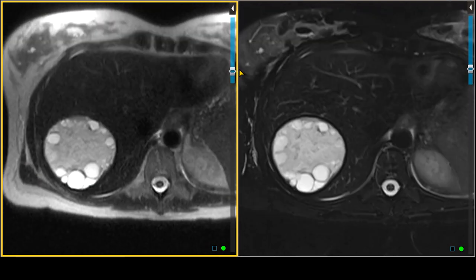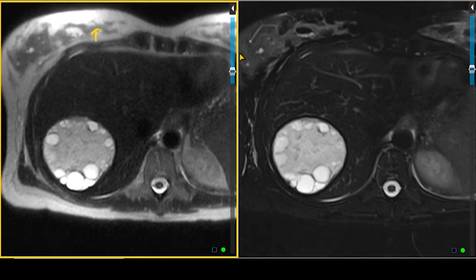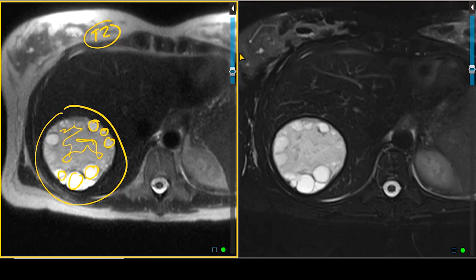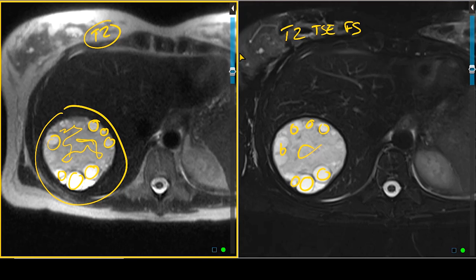On the T2-weighted images performed without fat saturation, we can see a rather large mass in the right hepatic lobe with a very interesting appearance. It is pretty well defined. Internally, it has mostly intermediate T2 signal throughout most of it. But there are discrete clusters of more hyperintense T2 signal seen along the periphery of this mass. On the T2 turbo spin echo fat-saturated imaging sequence, these findings are re-demonstrated, with intermediate signal centrally and more discrete areas of hyperintense T2 signal along the periphery of this lesion.